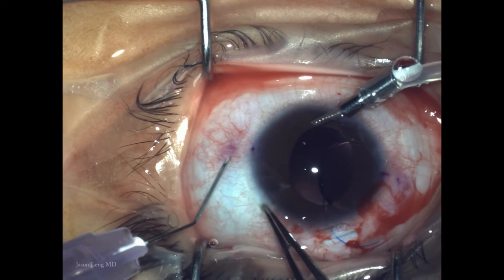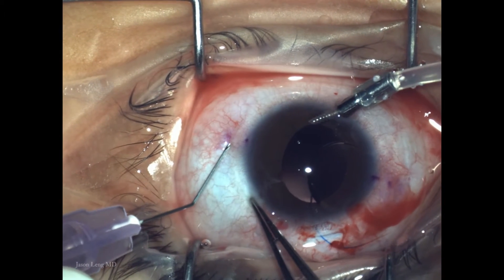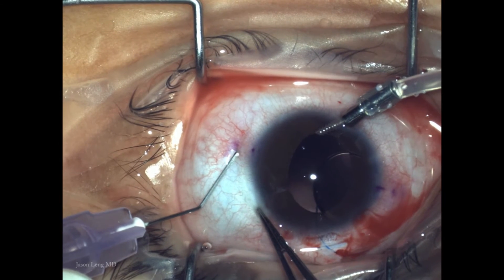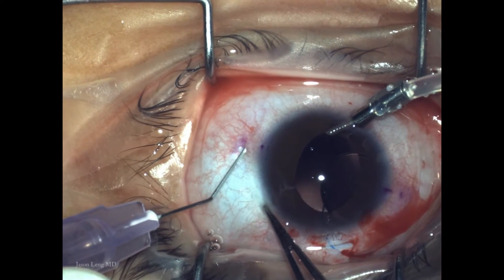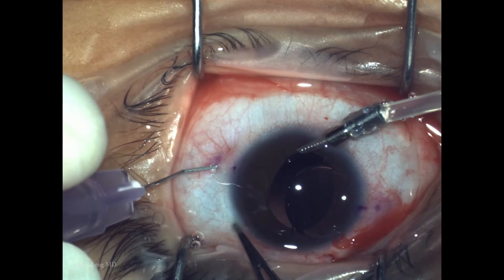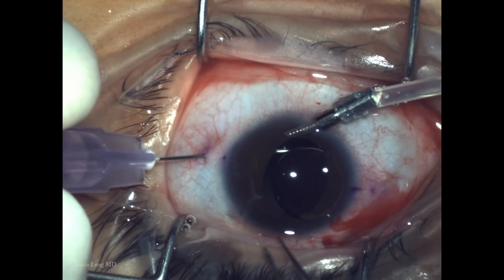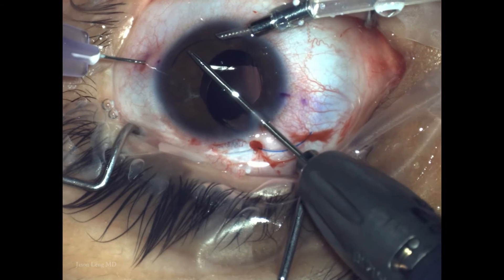Here I'm creating another paracentesis for access later. Next I'm using a 30-gauge large-lumen 1.5-inch needle made by Nipro, available in the US. I put a bend in it so I can get a good angle into the eye, going through the conjunctiva and sclera at about a 30-degree angle to create a short tunnel.